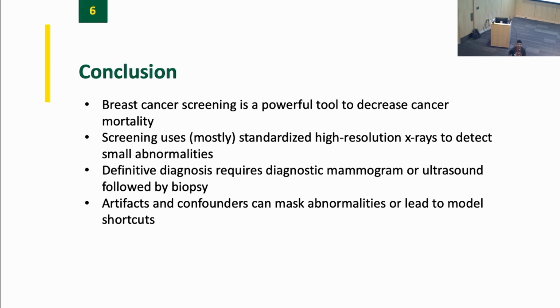Ideally, the question is, you may have 10 different X-ray machines at Emory. We'll probably have 40 for mammography. Almost all of ours are Hologic, which is a brand, but you need your model to work on GE scanners and Siemens scanners and Toshiba scanners, and all of them have different noise profiles and different artifacts in the image that we as humans probably can't pick up, but machines will definitely pick up.